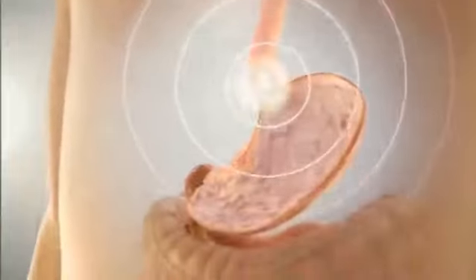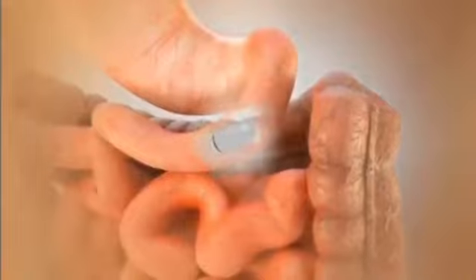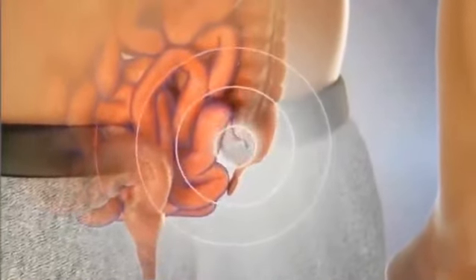Capsule endoscopy is a procedure that uses a tiny wireless camera to take pictures of your digestive tract. A capsule endoscopy camera sits inside a vitamin-sized capsule you swallow. As the capsule travels through your digestive tract, the camera takes thousands of pictures that are transmitted to a recorder you wear on a belt around your waist. Capsule endoscopy helps doctors see inside your small intestine, an area that isn't easily reached with more traditional endoscopy procedures. Traditional endoscopy involves passing a long, flexible tube equipped with a video camera down your throat or through your rectum.